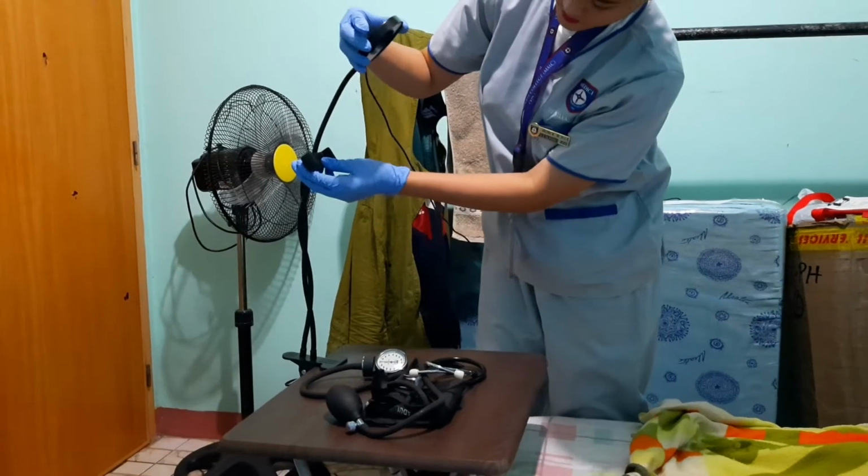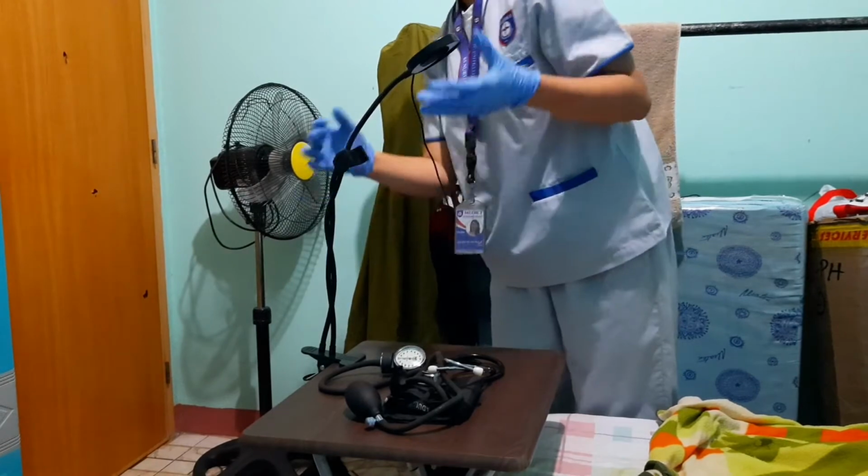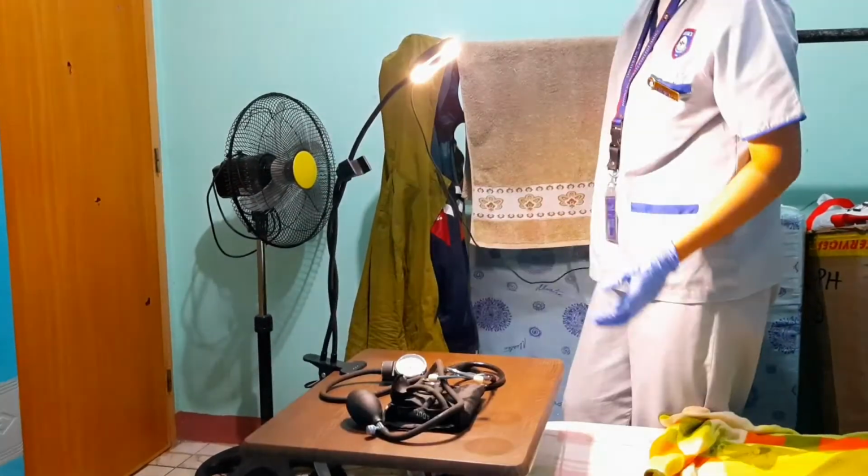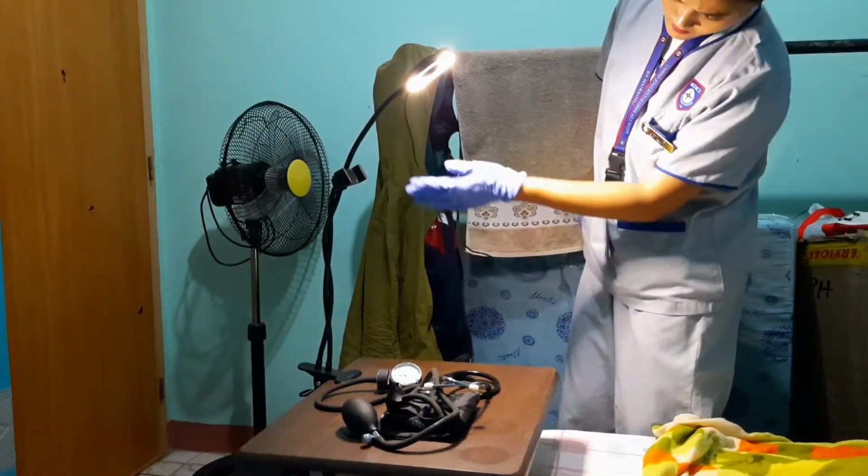And after that, we have to check the doctor's order, and the order must include frequency and duration of application. And it is stated here that the prescribed time is for about 15 to 20 minutes only. And after that, we have to obtain the Perilight and check for proper functioning and condition of the equipment. And we also have to use a 40 watts bulb only.